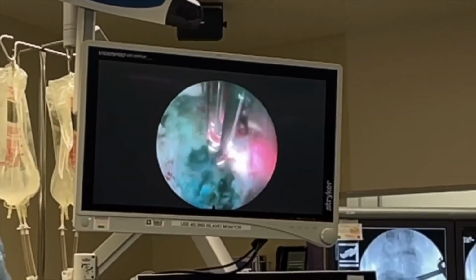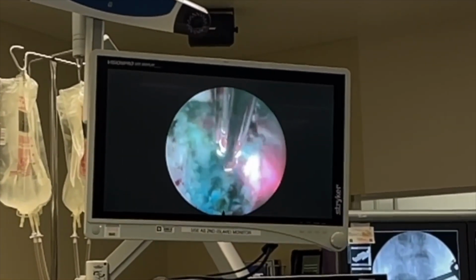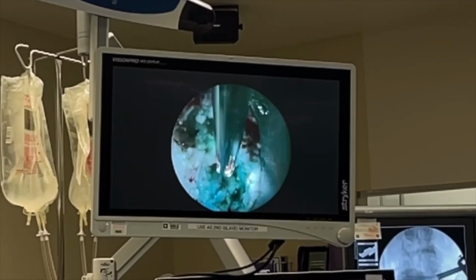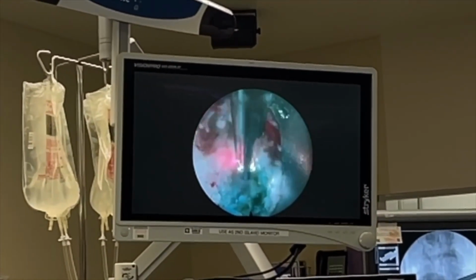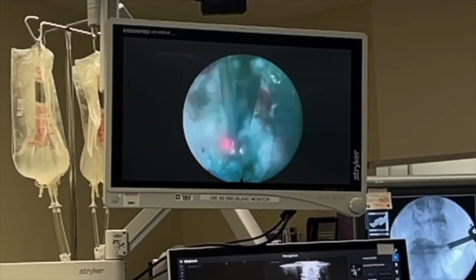See that? Last minute touches. That's the bony osteophyte of L5. The nerve root is on the right side of that metal wall. Shielded like a chastity belt.